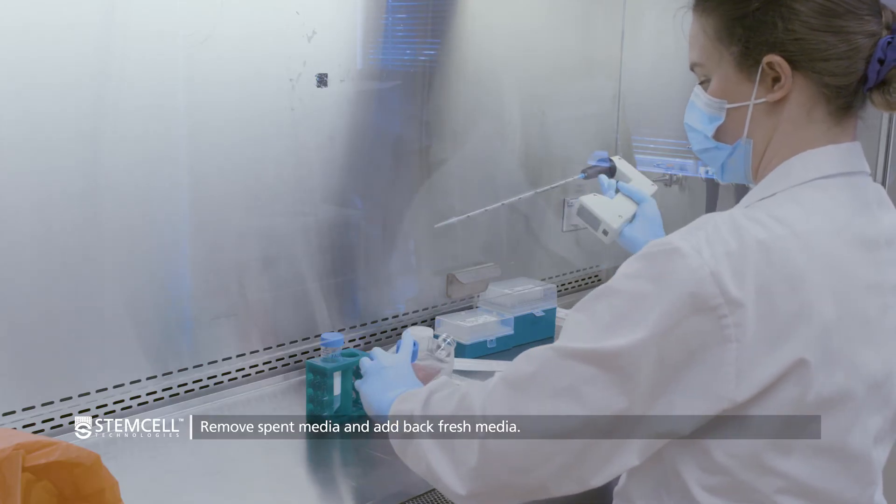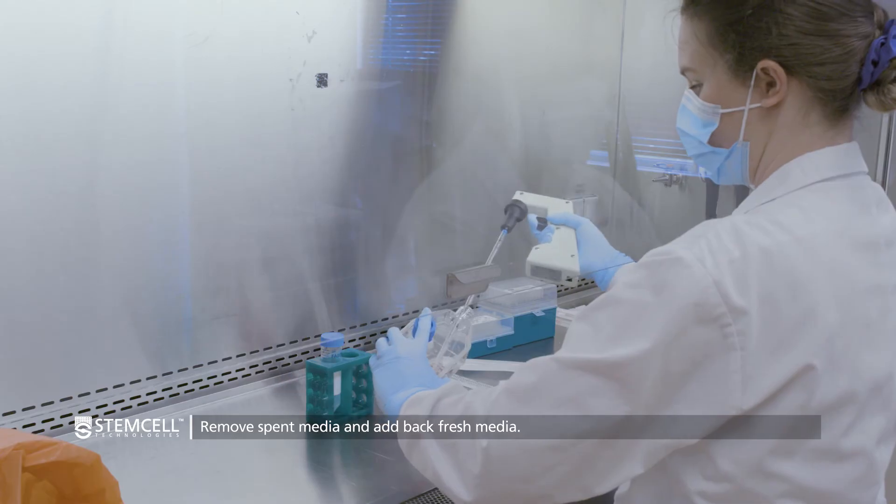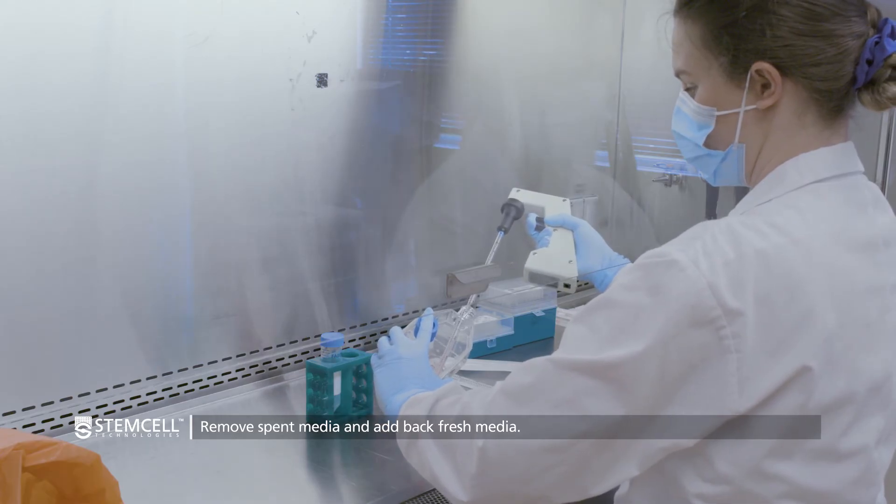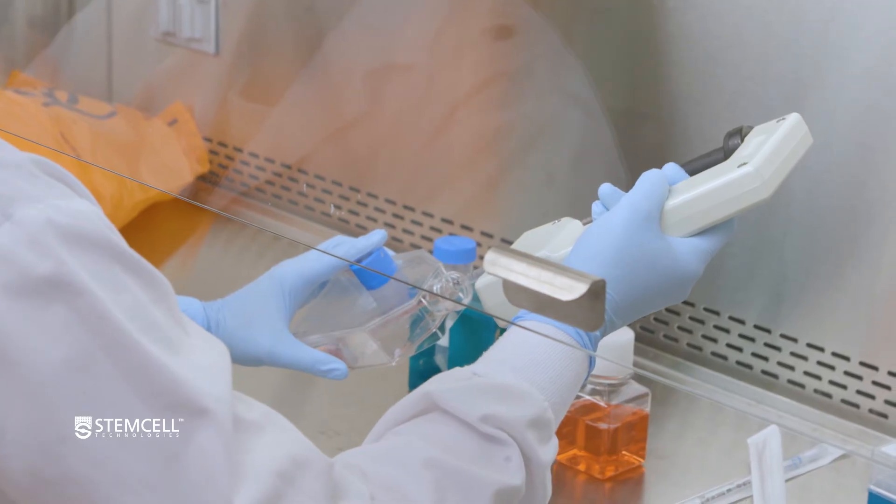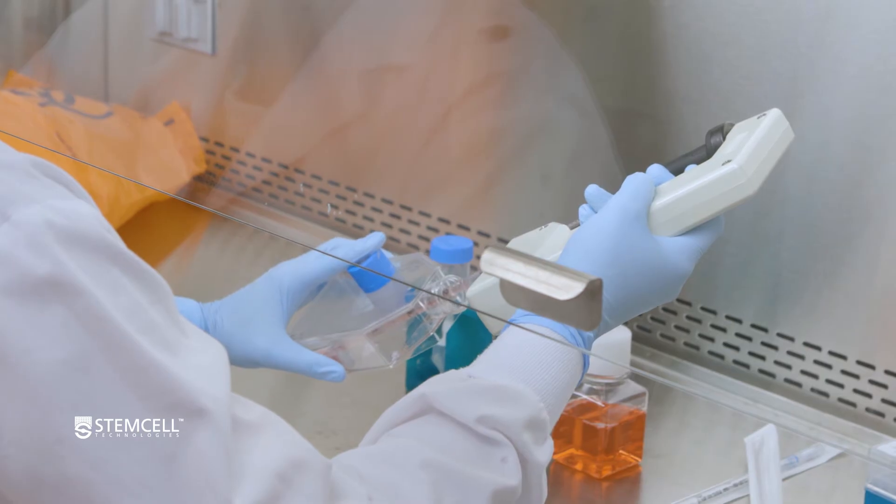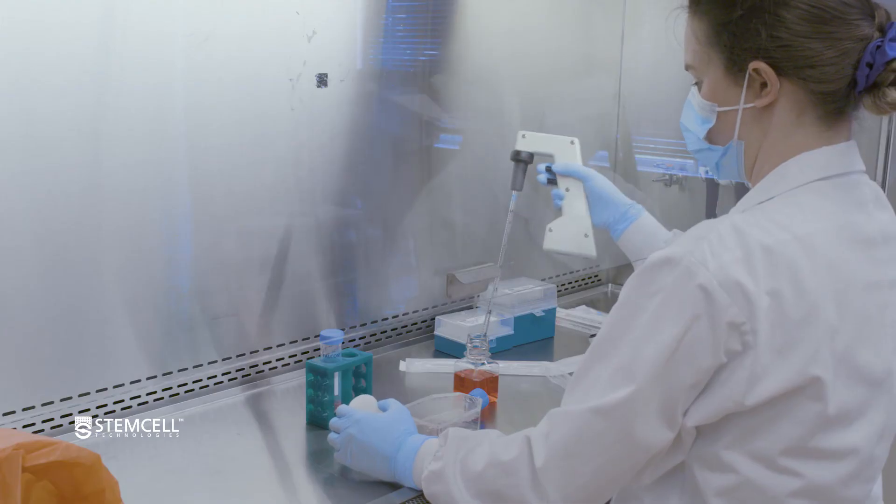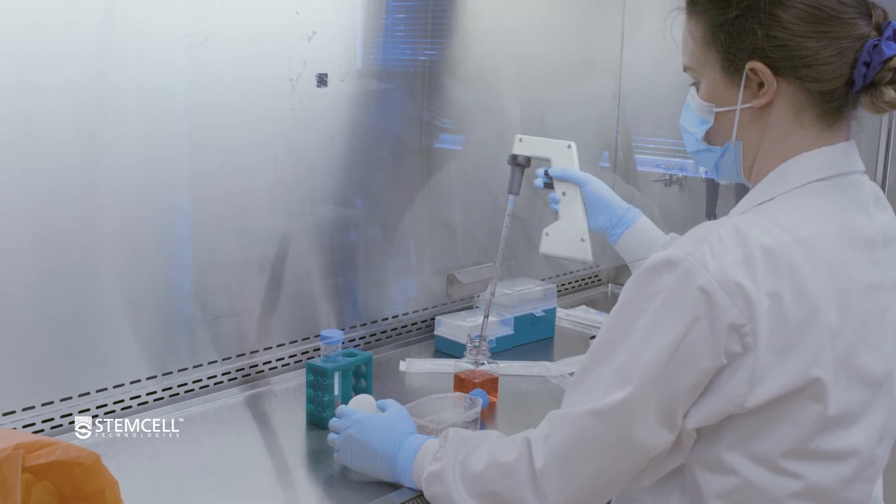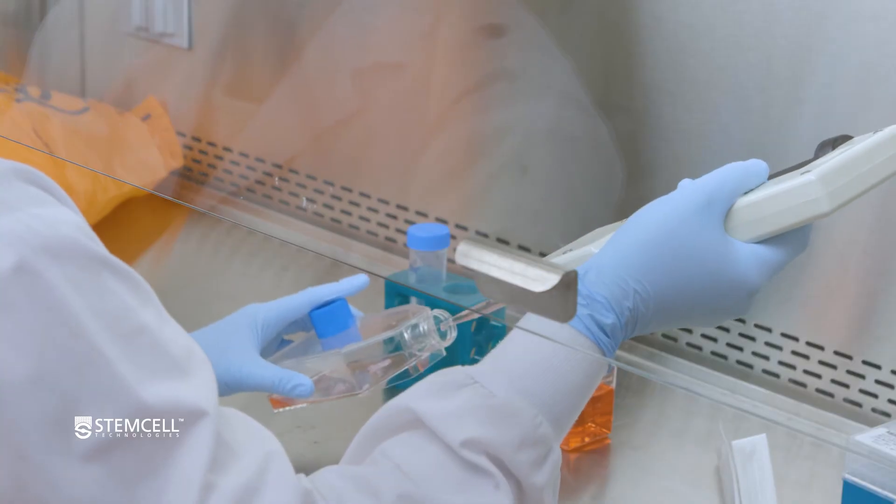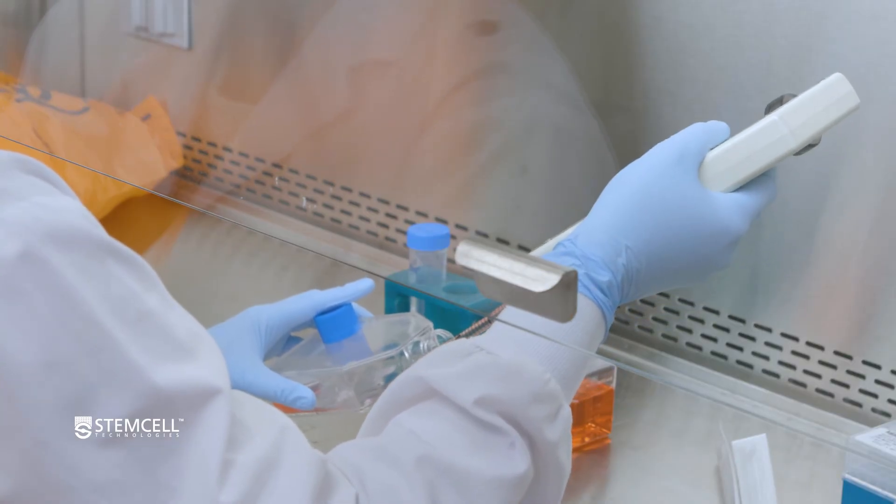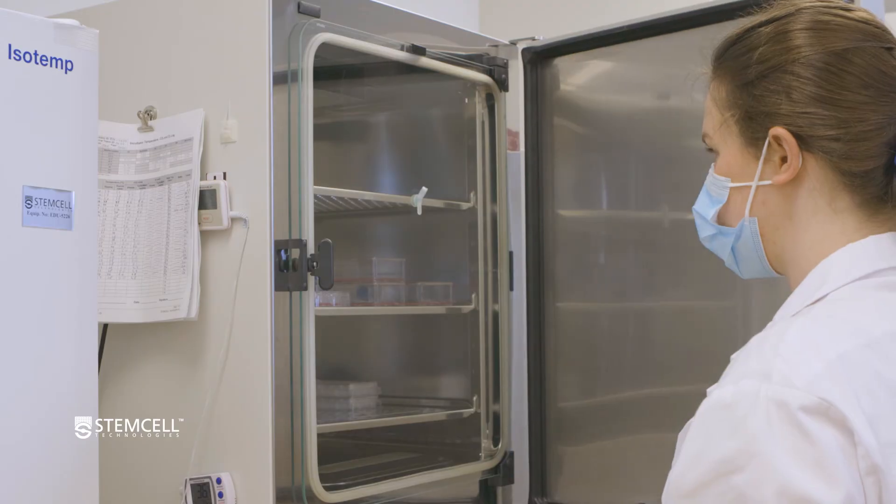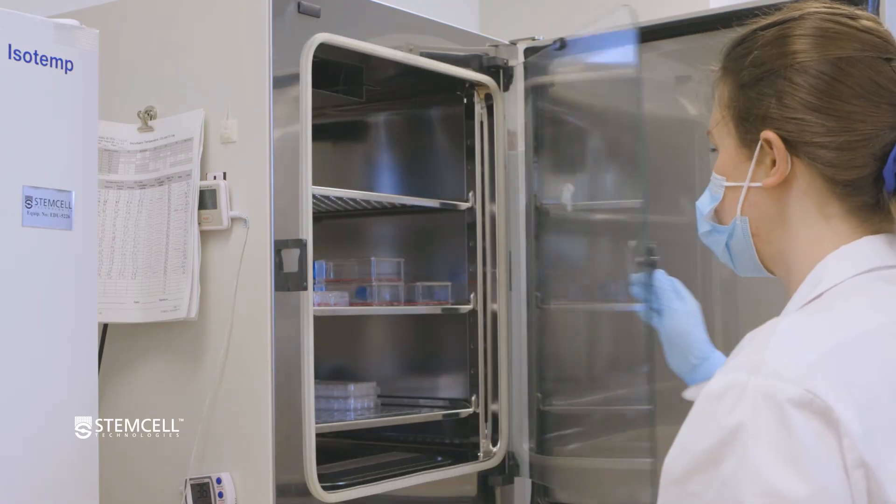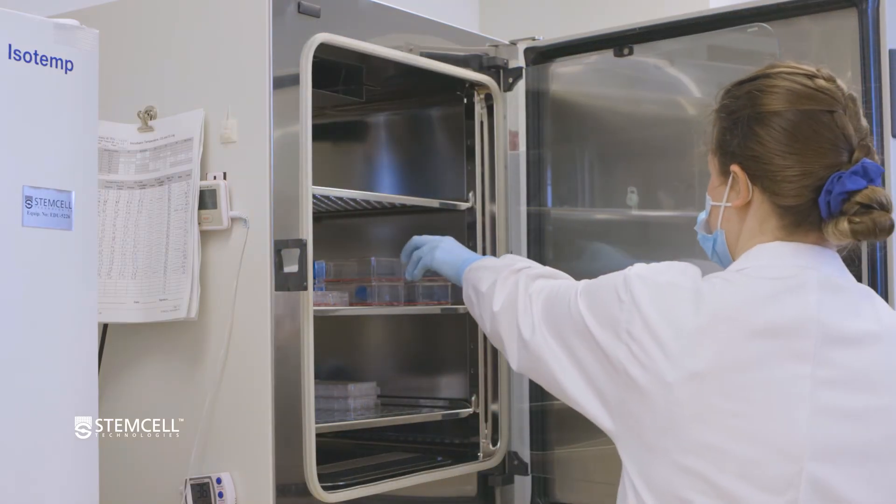To perform a half-medium change, tilt the flask back to pool the media. Then remove 4 ml of spent media without disturbing the attached tissue. Some unattached tissue pieces may be removed in this process, but this is normal. Slowly add 5 ml of fresh MesenCult ACF Plus umbilical cord medium. Incubate undisturbed at 37 degrees Celsius for another 5 to 7 days.